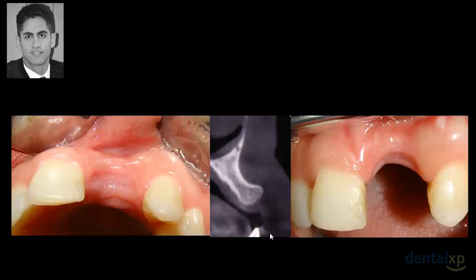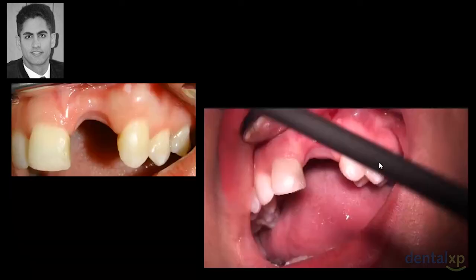So, should we place the dental implant with simultaneous augmentation? Well, we should place the dental implant in the area where it should be, not in the area where the bone is. So where should we put it? Usually centered to the palate, under the cingulum area of the central, and we can compare it to the adjacent central also. And then we can build up this contour and this tissue, wait, and come back for the prosthetic approach.